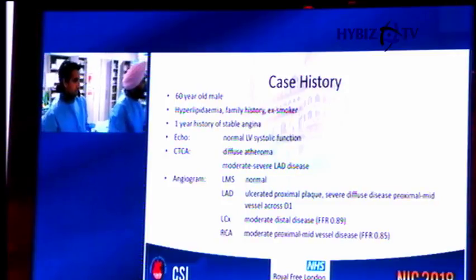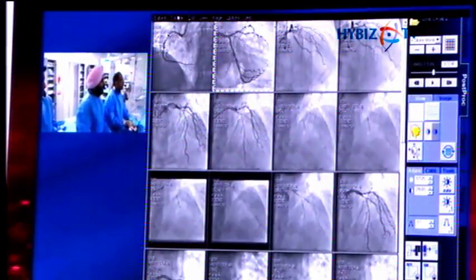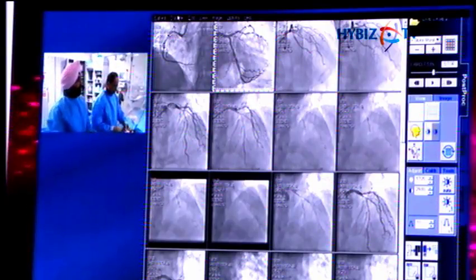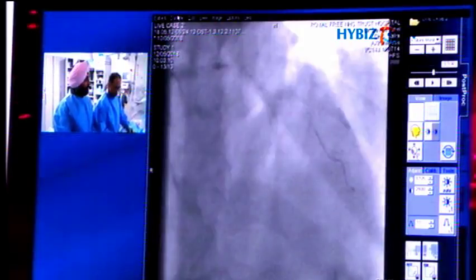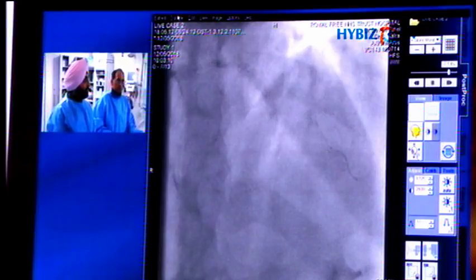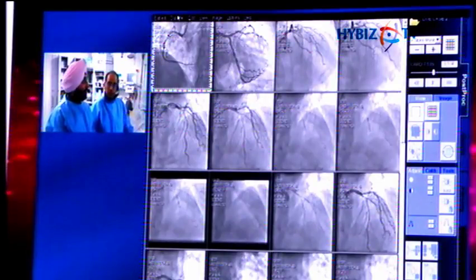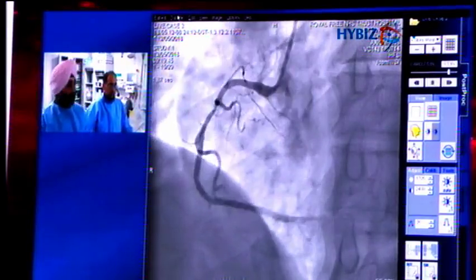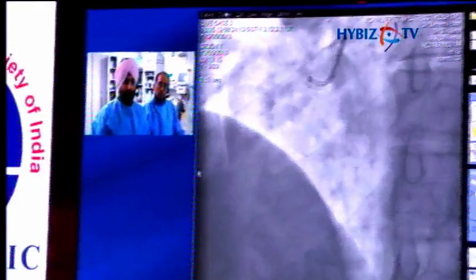So we've just taken a couple of diagnostic pictures again now. This gentleman had his pressure wire studies performed about 2 weeks ago. So if we just go to acquisition number 1 there, please, Peter. So this is just the first shot, please, Peter. We're just going to show the right coronary artery first. So if you just play that, please. So right coronary artery here in an LAO projection. This was pressure wired 2 weeks ago, and the FFR was 0.85 in that, so we did not proceed to PCI of this vessel. We'll go forward another view, 2 views, please.